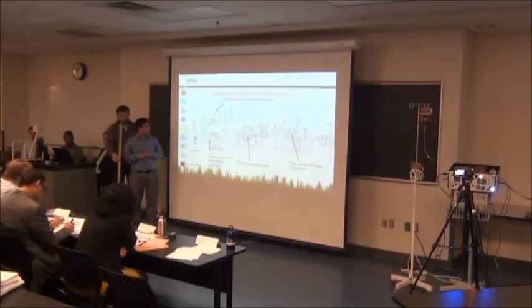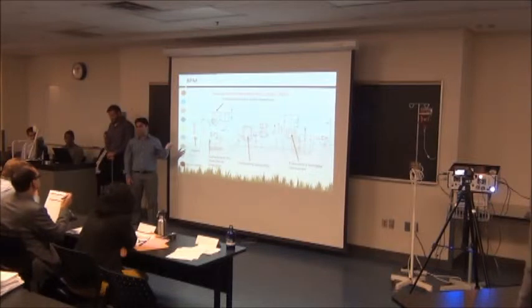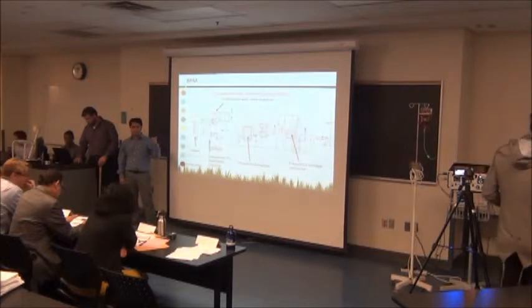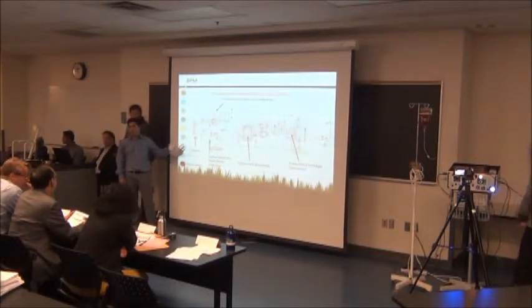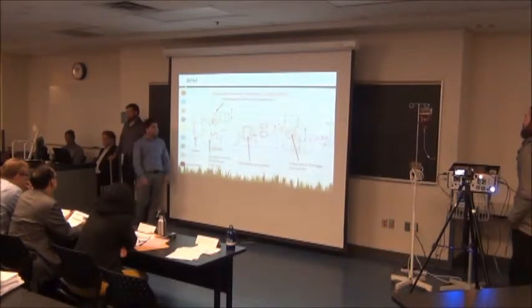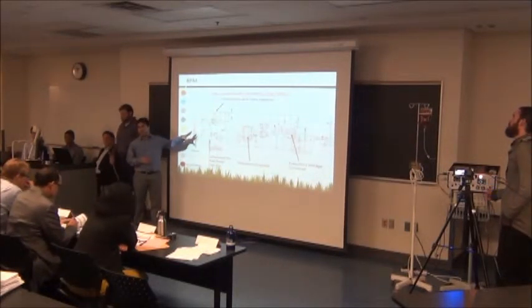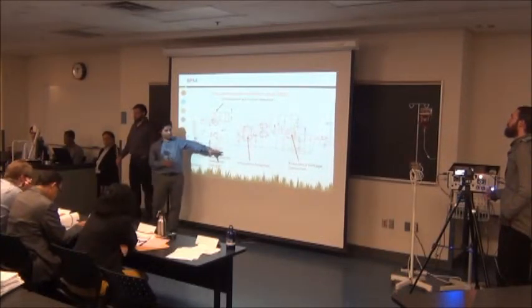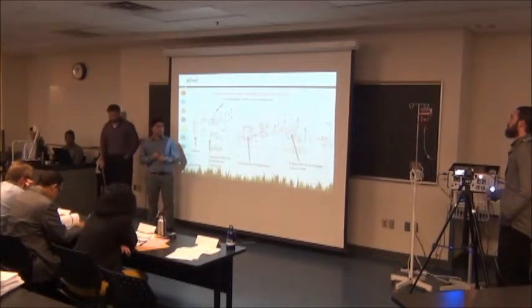Basically the frequency response of the pressure signal is around 2 Hertz. So basically the circuit takes the frequency and converts the frequency into voltage. Because the frequency is too low, we need to amplify. We need to multiply that frequency by 100 or 1000. So basically, we are taking the pressure signal and converting it into the pulse waveform, and we are multiplying with the frequency amplifier circuit, and that frequency amplification can be converted into voltage.